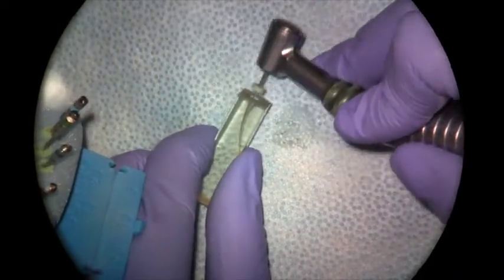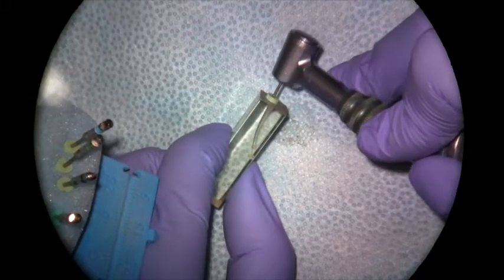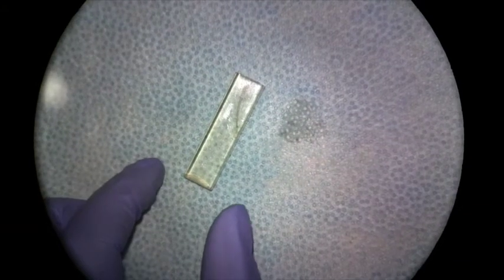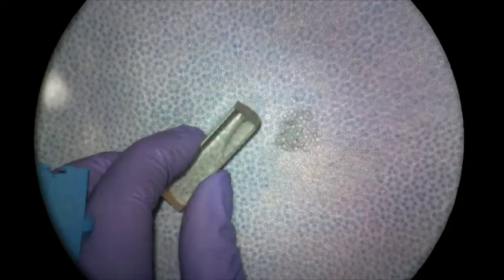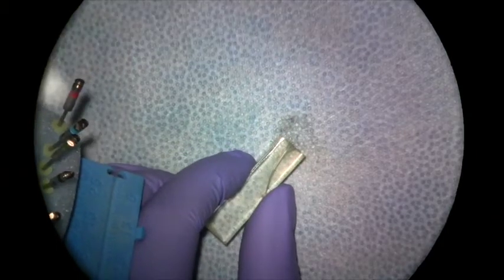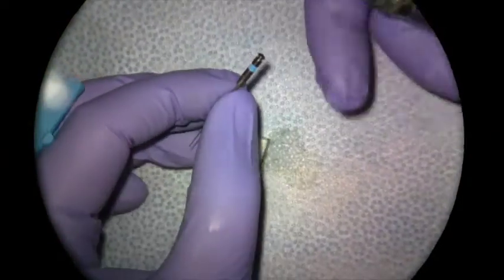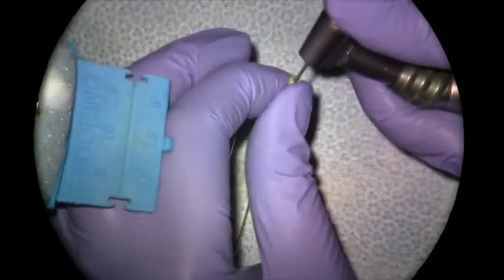Now I'll go back in with my 25.04 — and now this is getting to length. Once I have my 25.04 to length, I can apically enlarge from there to create the MAF size I want. If I've determined I want to instrument this canal to a size 30, I'll go in with the 30 file. After recapitulating, I'll measure the 30.04 to 17 and place it in my canal — and it's getting close to length but still not quite there.